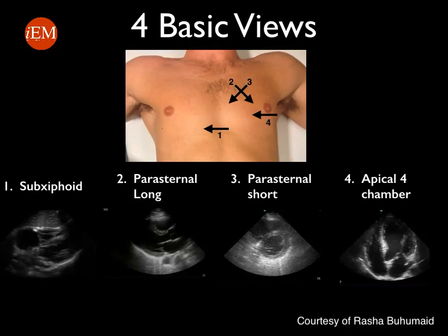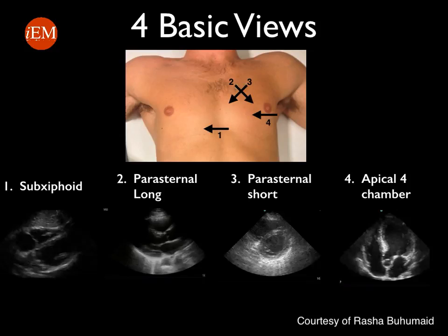So this is a summary of the four basic echocardiography views that are obtained using point-of-care ultrasound.